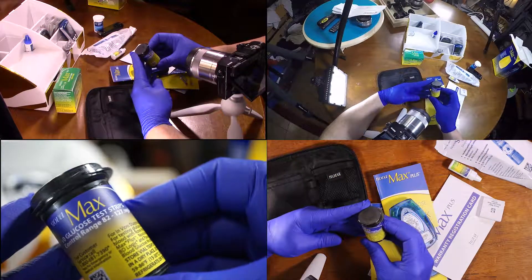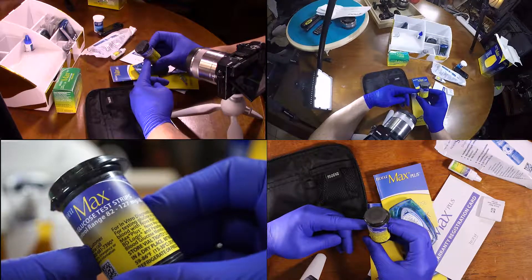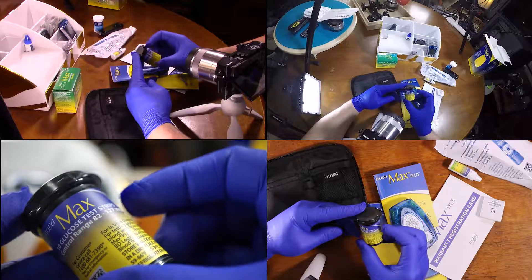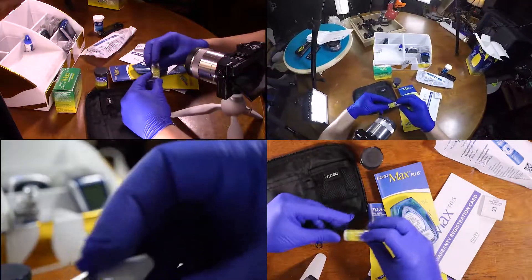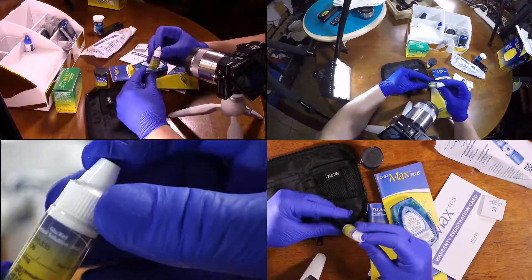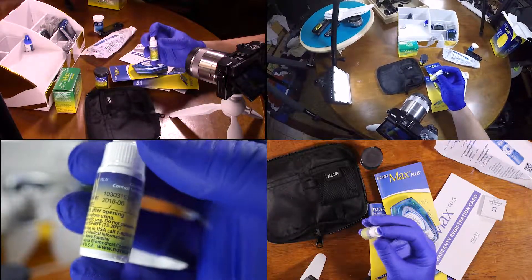We've got 10 glucose test strips. We've got a control range of 82 to 127 milligrams per deciliter. Discard six months after opening this container — there's a place to put your date right there. We've got our control solution, which will help potentially deal with any troubleshooting we'd have to do.